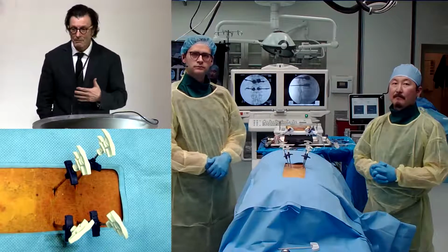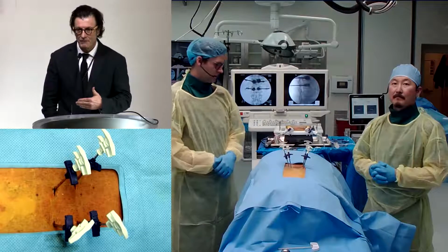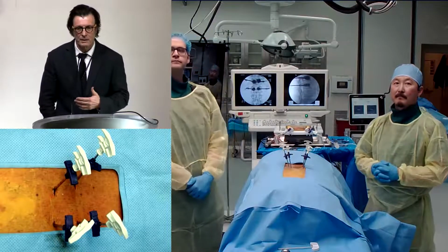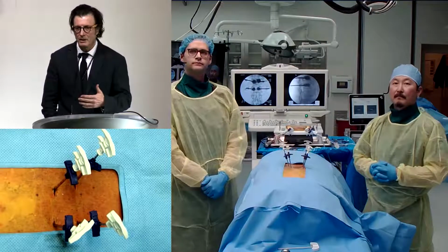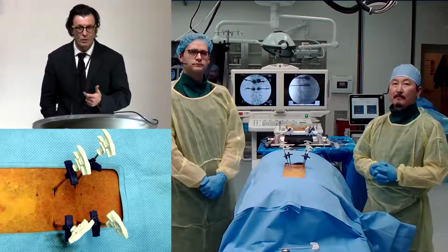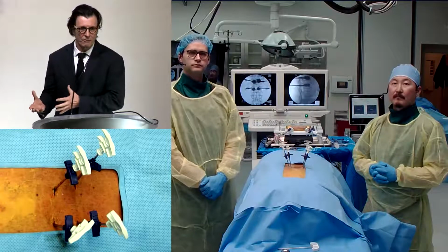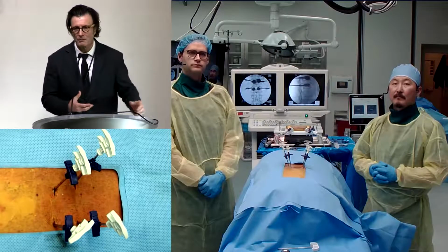But what happens a lot in this situation, when patients come in with dense neurological deficit and you have to go in and take the cement out, is you're already dealing with patients who have an issue. They're either very osteoporotic, or this is a tumor case in a patient who probably was not a candidate for a vertebrectomy, which is why you're doing the vertebroplasty.